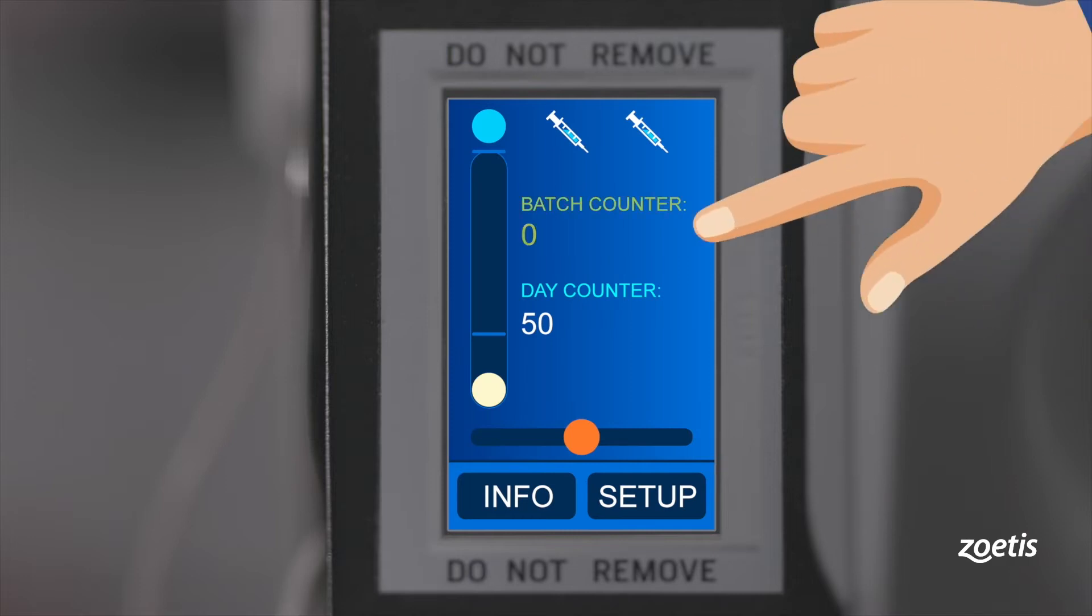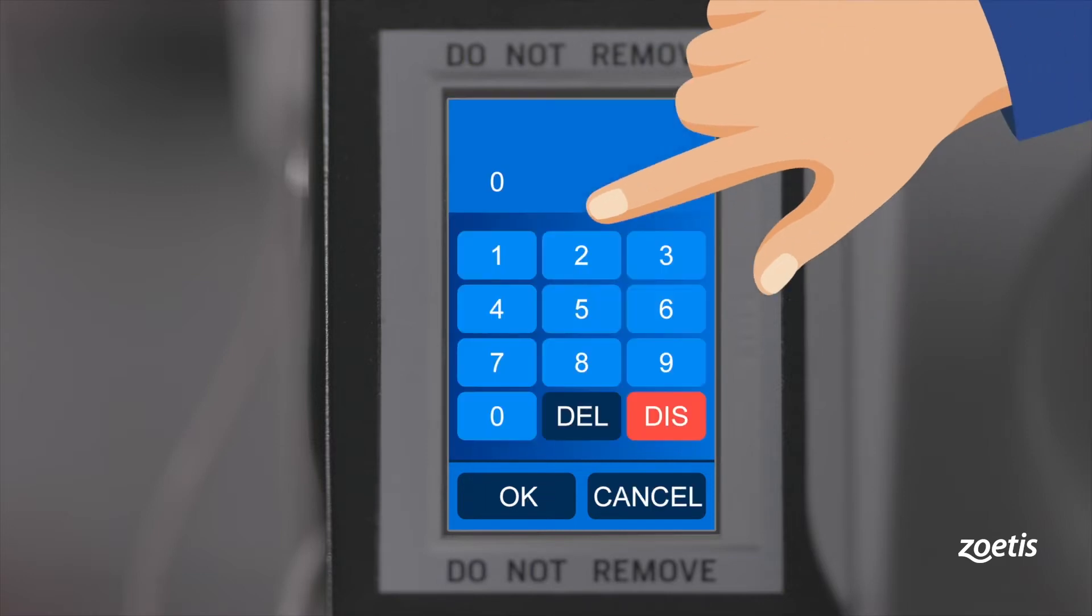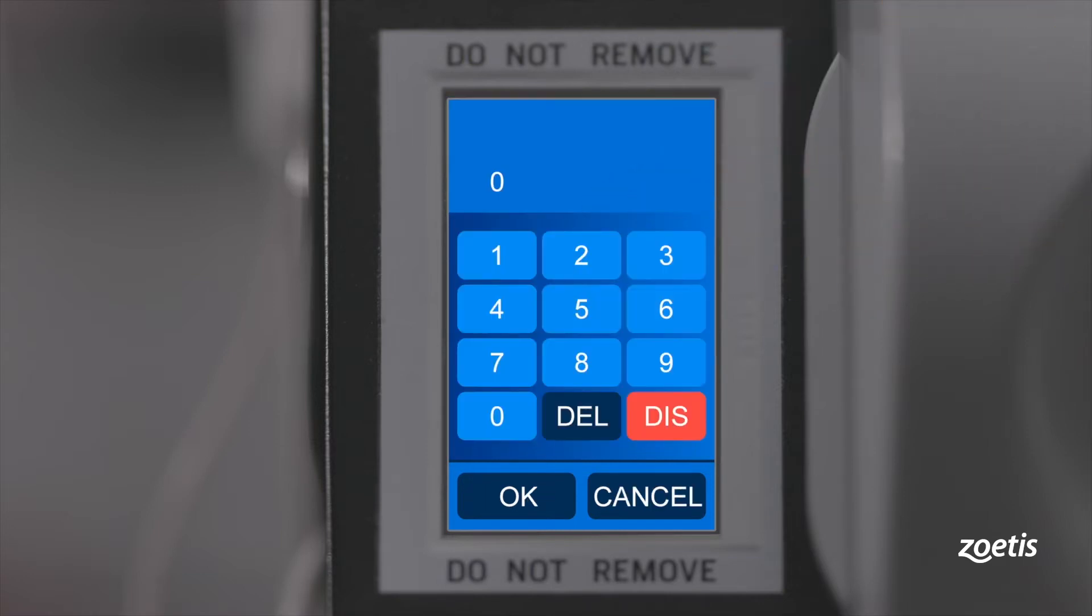Batch counter indicates the number of chickens vaccinated in accordance with the batch size. Please note that this function is switched off when the batch counter is set to zero. By pressing the batch counter, you can adjust to the desired number.